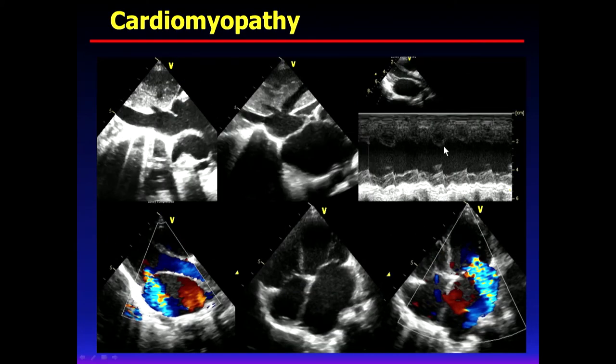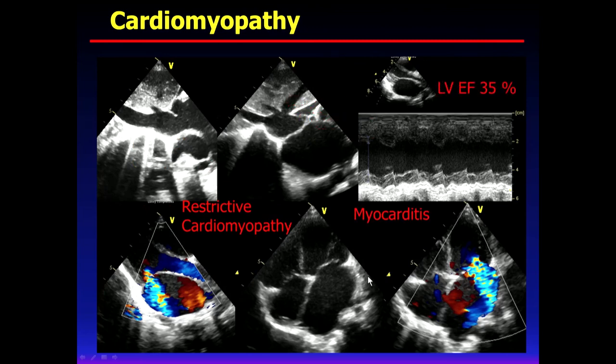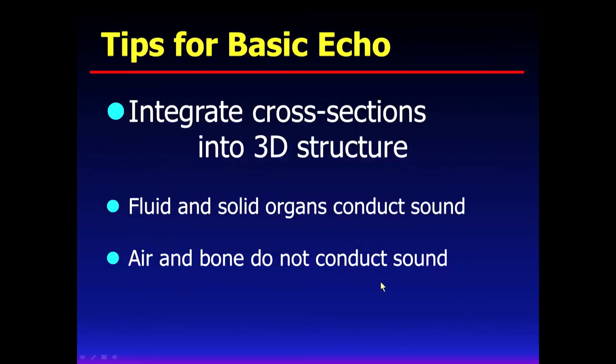And with cardiomyopathy, there are a lot of problems. The inside structure is okay, but the IVC is very, very dilated. And then the ventricle is dilated, the atrium is hugely dilated, and then mitral regurgitation. The outflow is very limited. All the regurgitant flow is there. Restrictive cardiomyopathy.